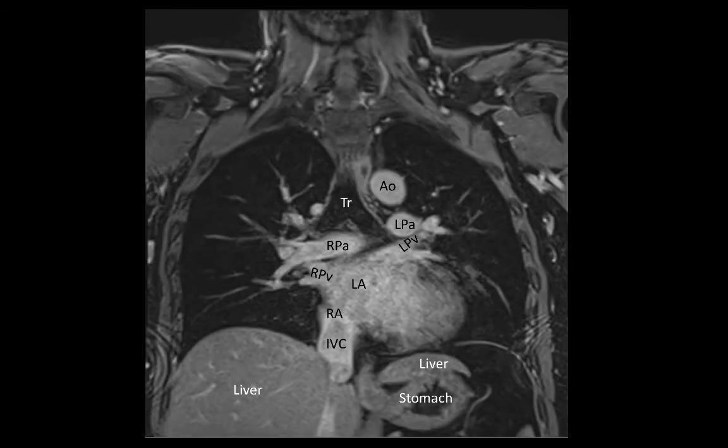In this plane we can see the carina of the trachea where it divides into the left and right main bronchi. We can also see the esophagus traversing the diaphragm through the esophageal hiatus.